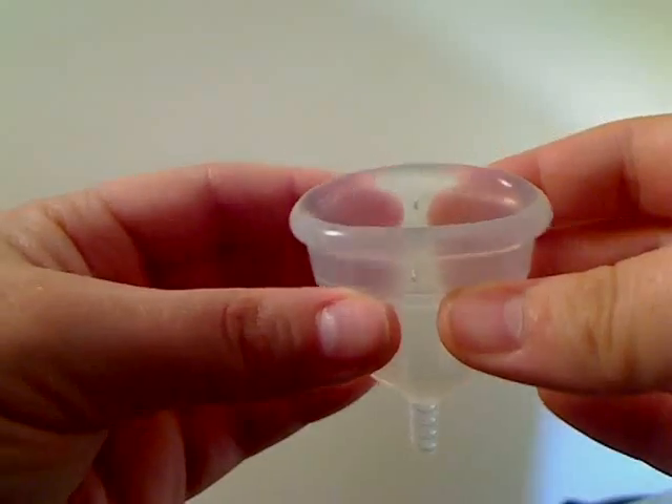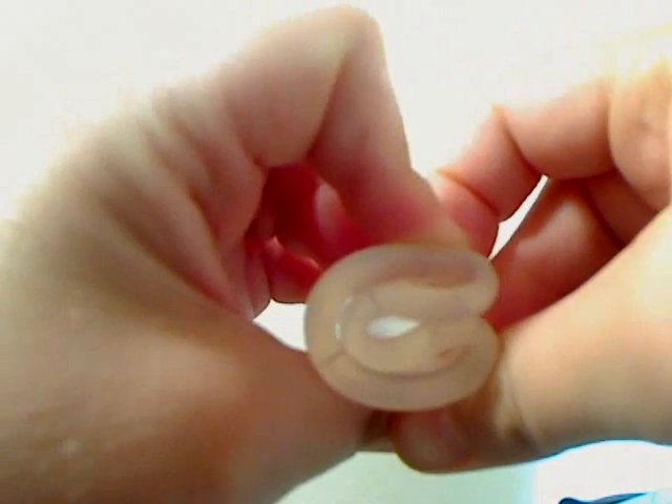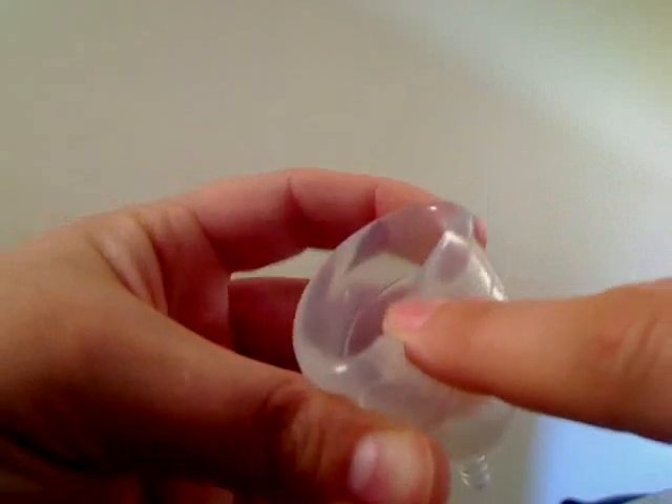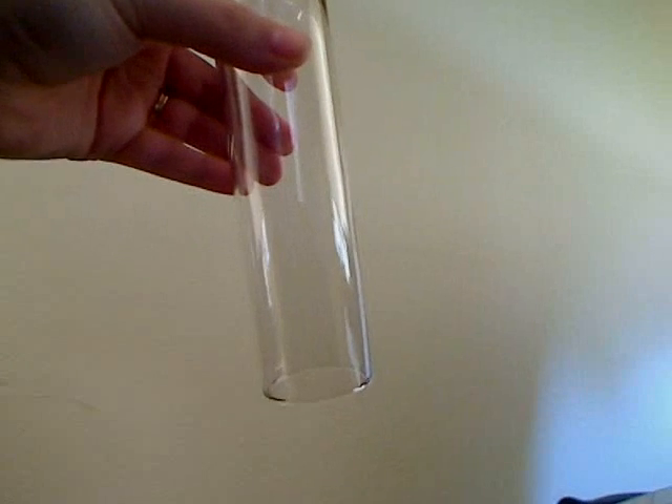You can either fold it in half lengthwise and then fold it in half again so that the rim forms a C shape, or you can do a punch-down fold where you just press the edge of the cup down into the center, and the other edge will come to a slight point, and you pinch it in that position.